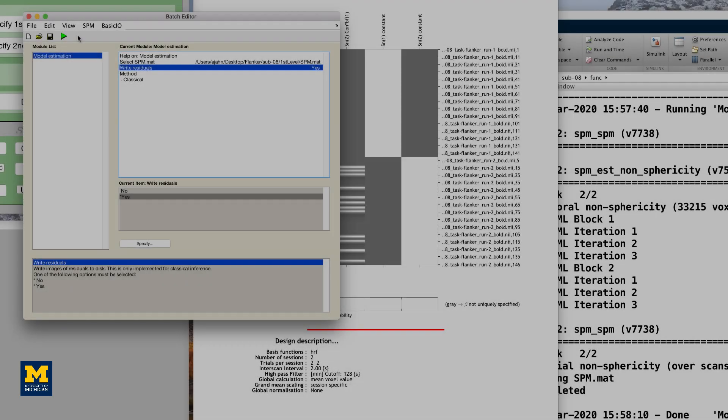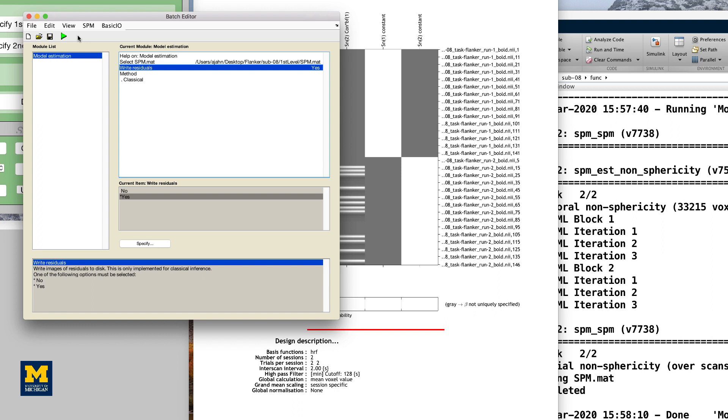When you have finished estimating the model, you are ready to create contrasts. If we estimate a beta weight for the incongruent condition and a beta weight for the congruent condition, for example, we can take the difference between them to calculate a contrast estimate at each voxel in the brain. Doing so for each voxel will create a contrast map.